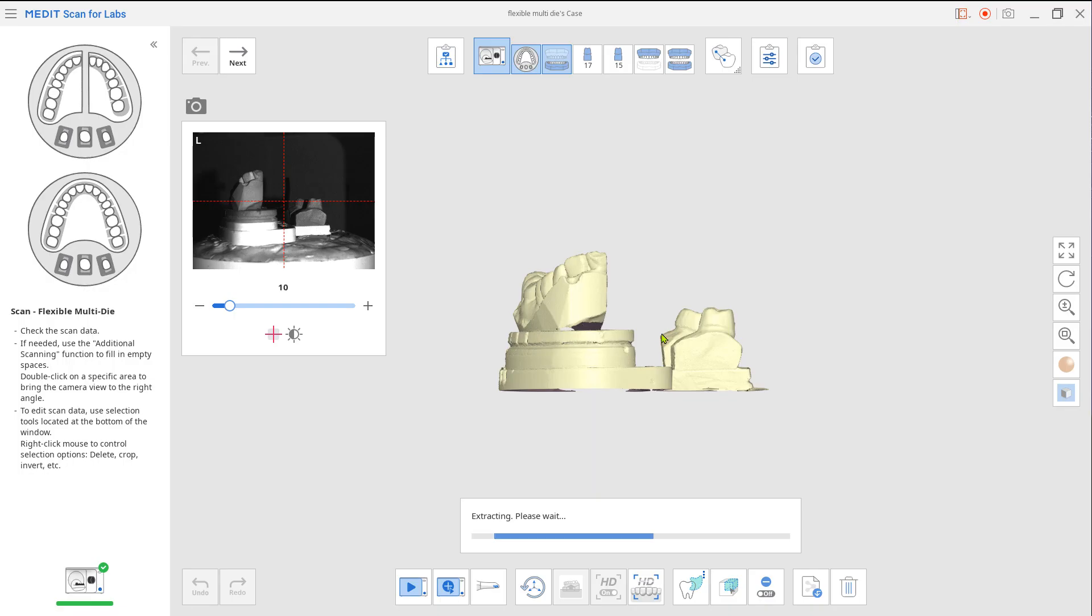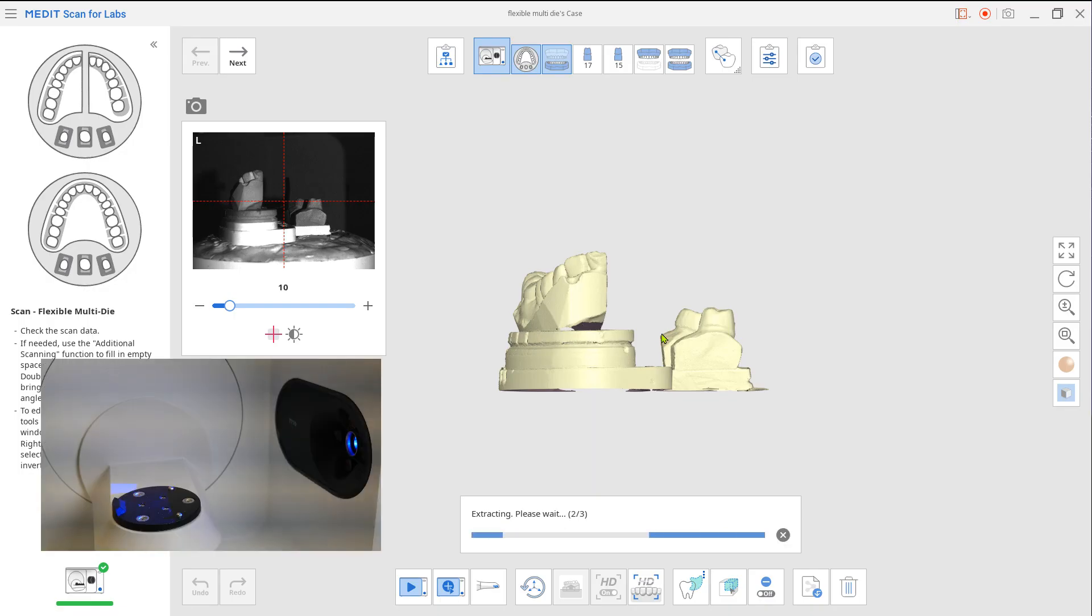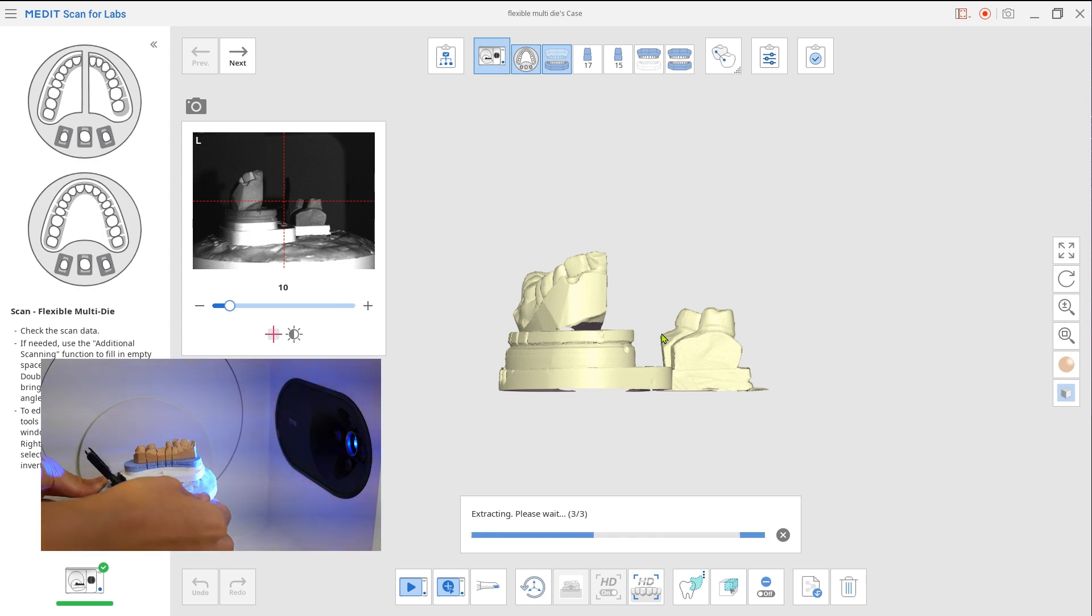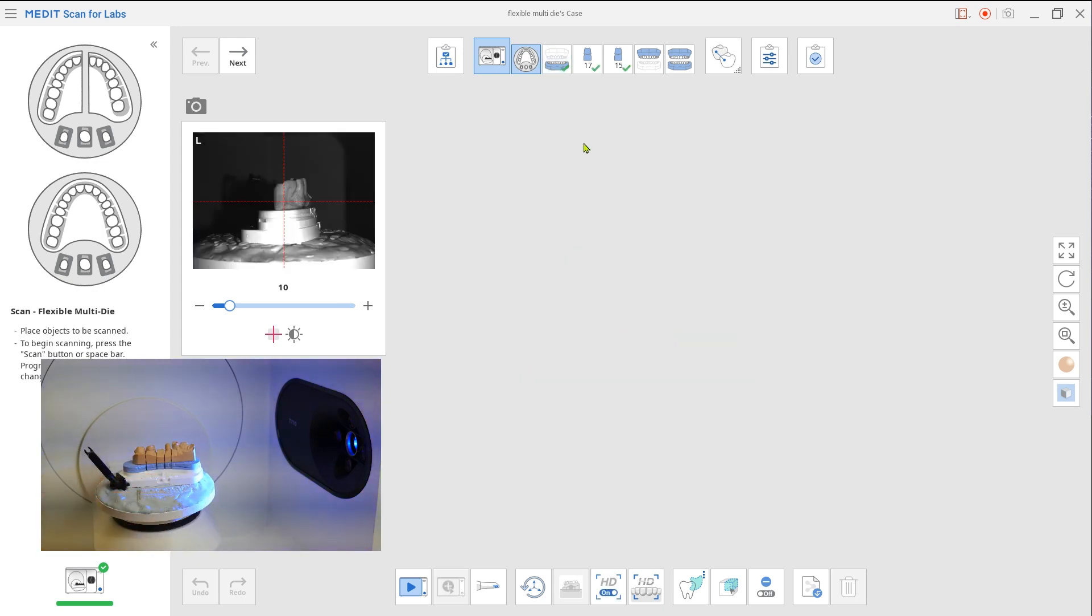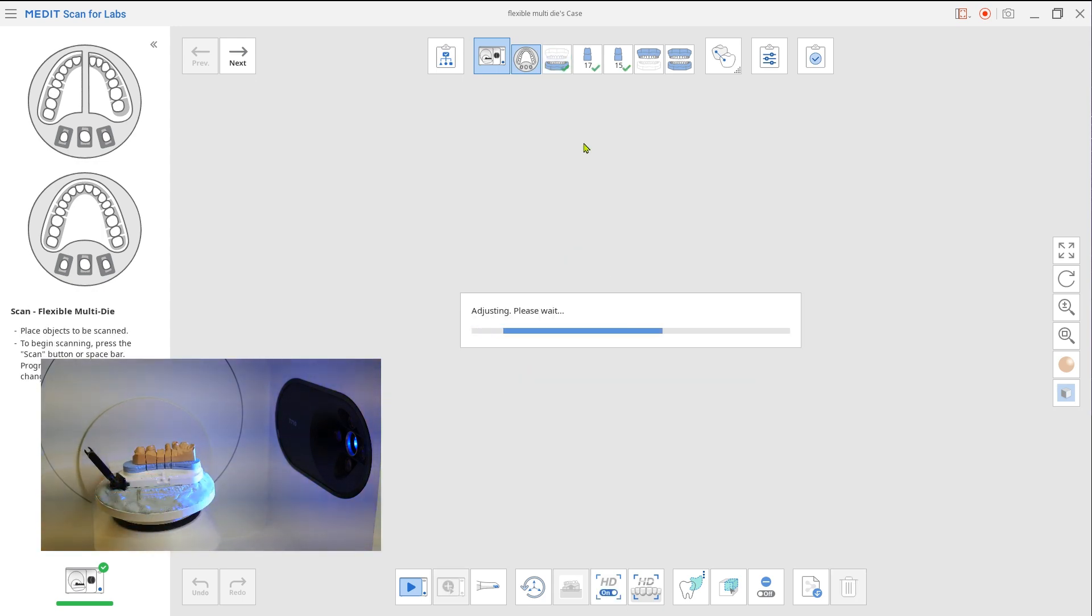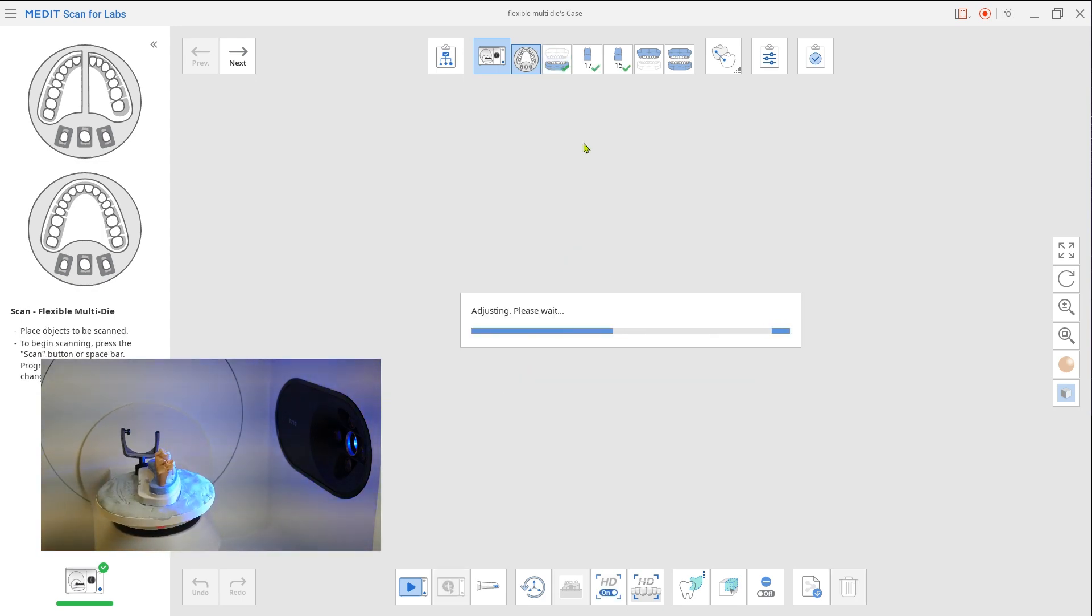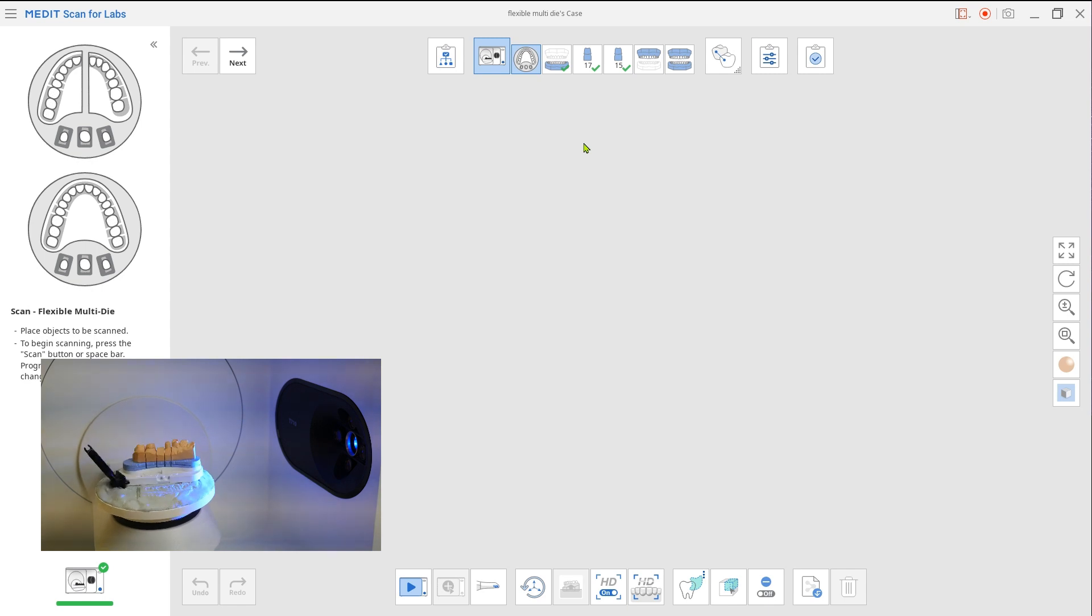Now the scan step goes back to the flexible multi-die for maxilla scan. Place the prepped teeth back into maxilla and do the scan.